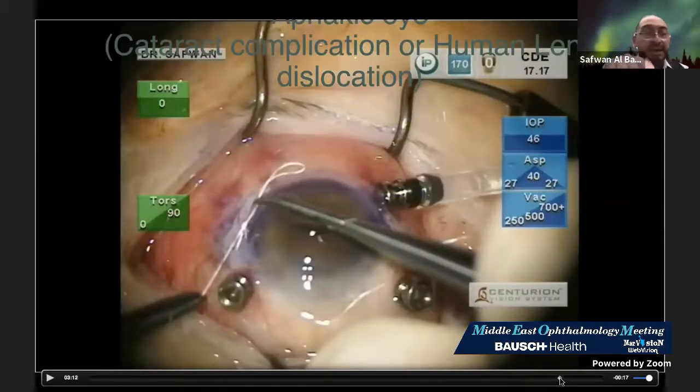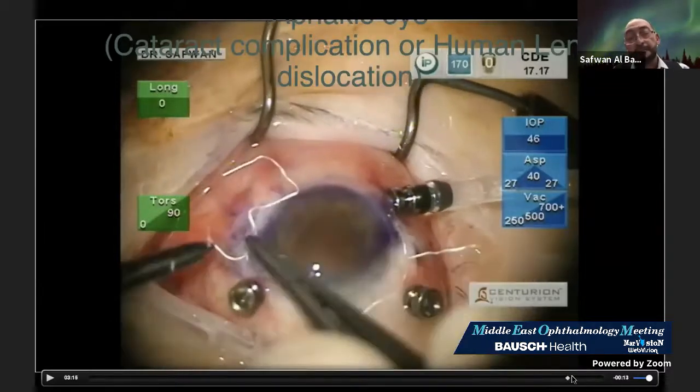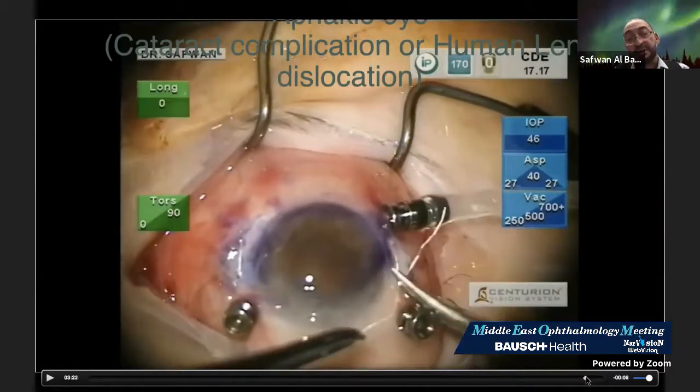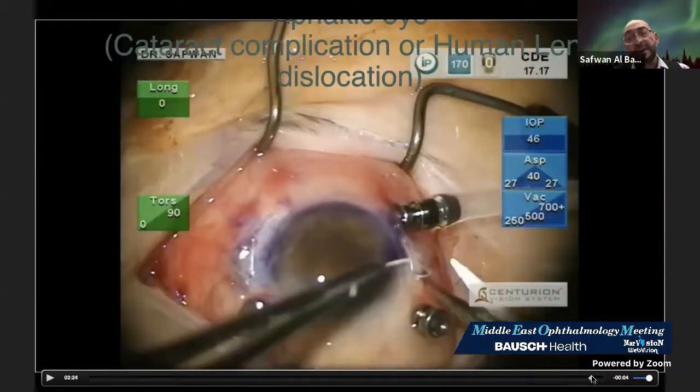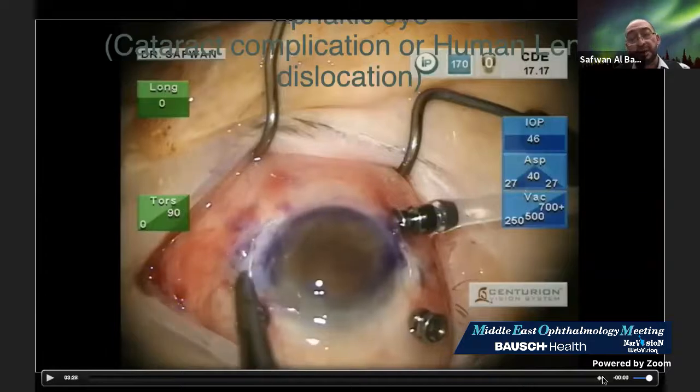So that's why here I need to stop, because Ashwin mentioned one thing related to the mobility of the lens, and that when the human being turns his head, the lens will move with it. I don't think that it's true with the Gore-Tex suture. So I can finish here tying, and then cut all the sutures, trim them, and bury them both, and then close the conjunctiva.